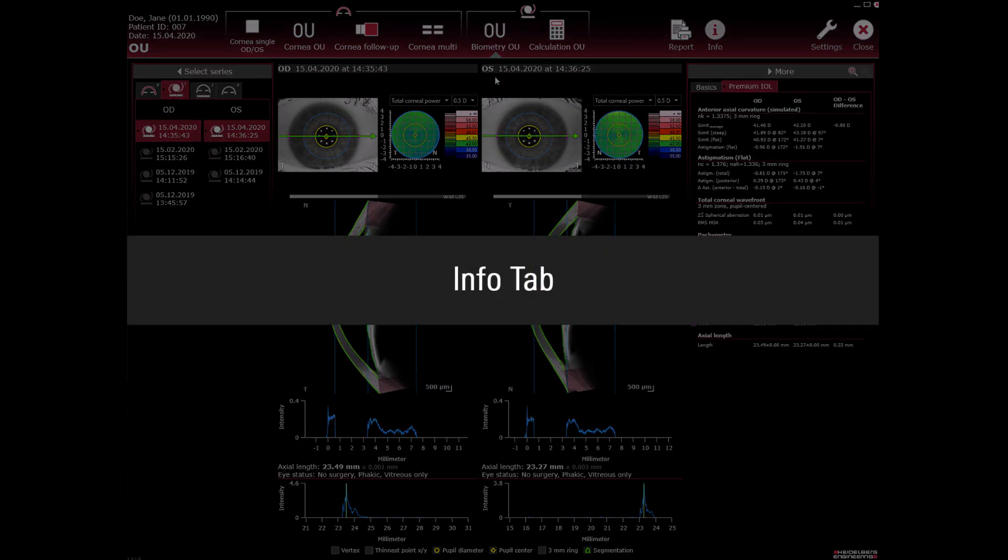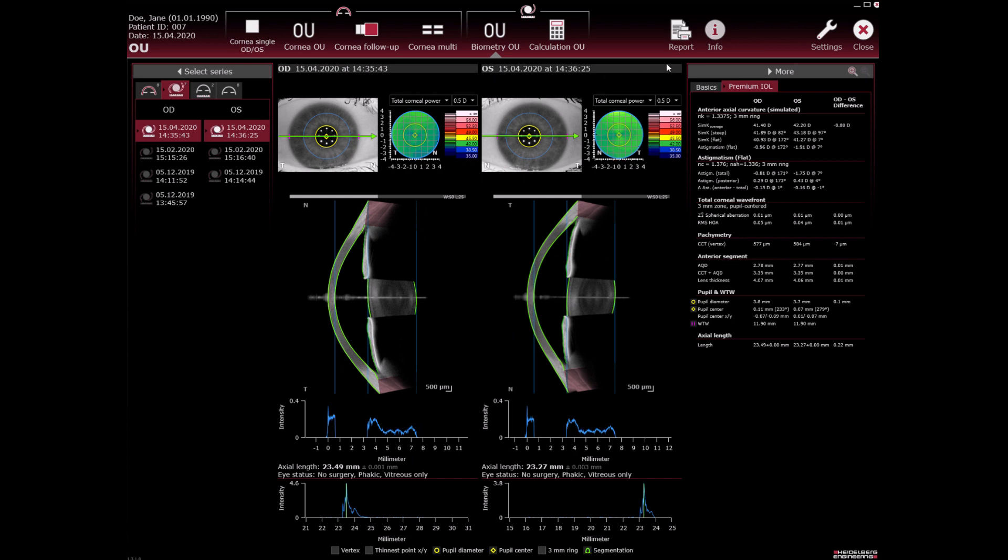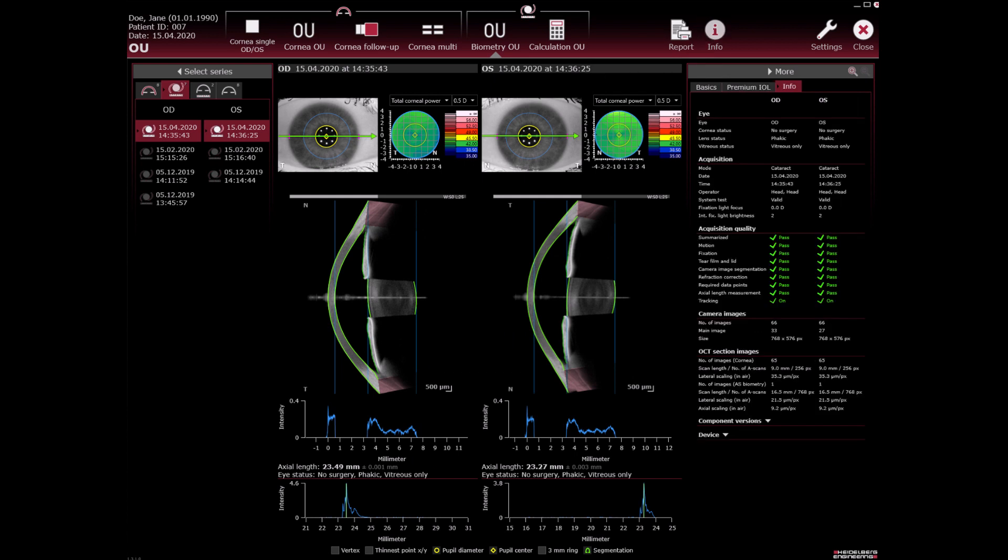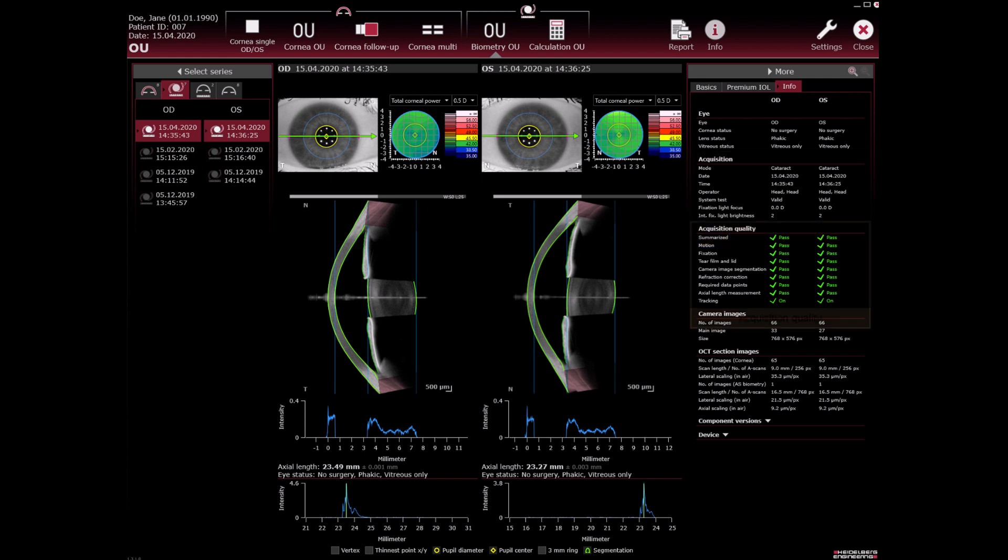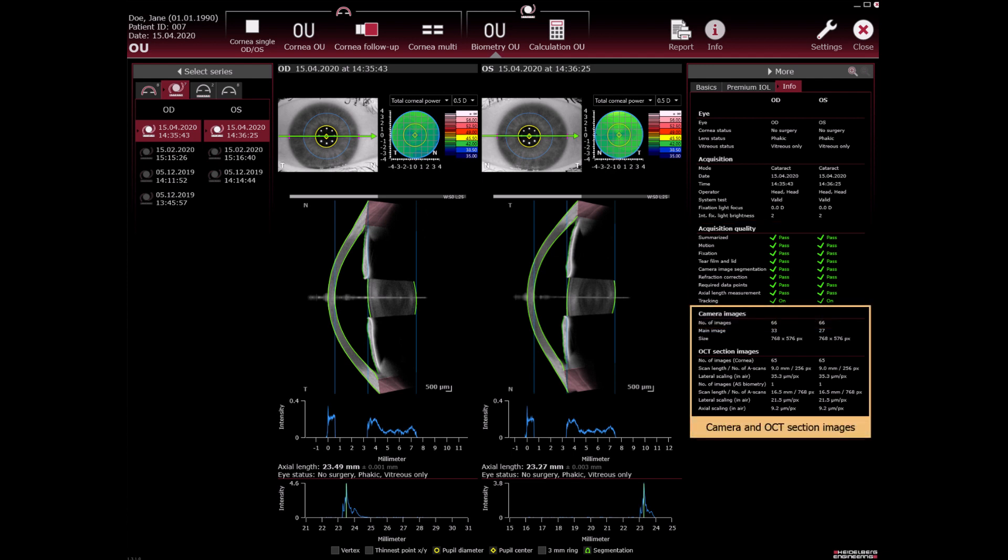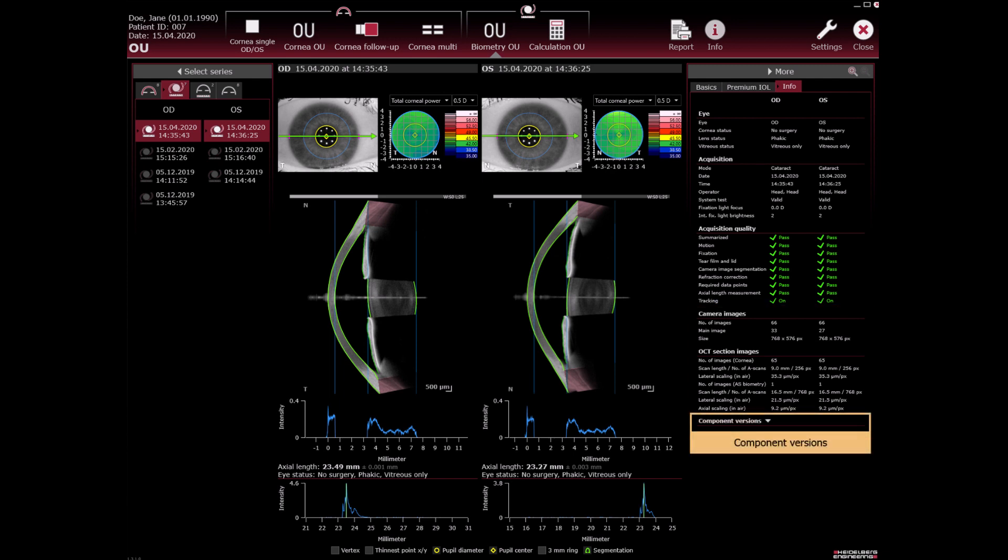Info tab. Info tab shows several informations. The eye status of the examined eye, acquisition information. Acquisition quality displays quality parameters dependent on the app of the currently loaded scan. Camera and OCT section images display parameters dependent on the app of the currently loaded scan. Component versions displays the version of the high X2 software used for the most recent changes.